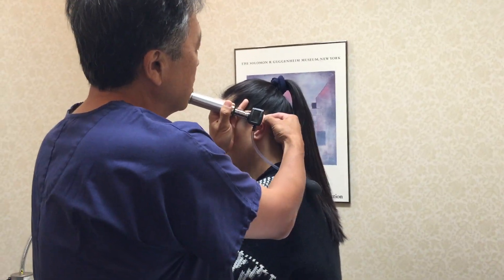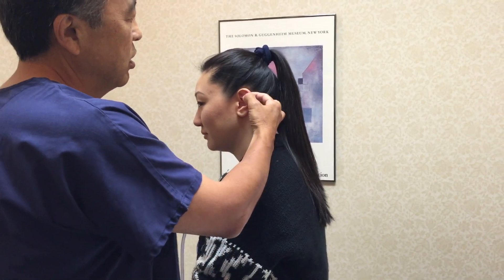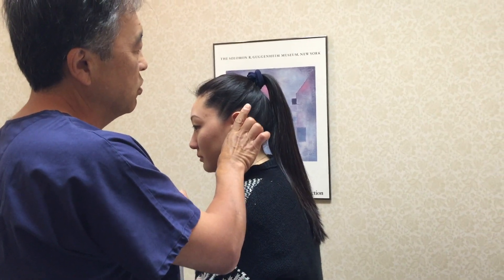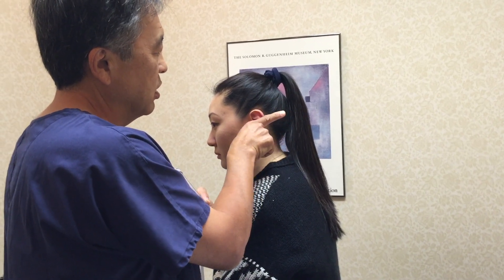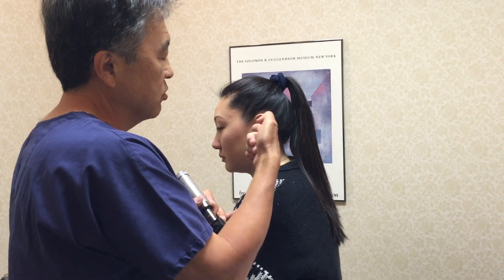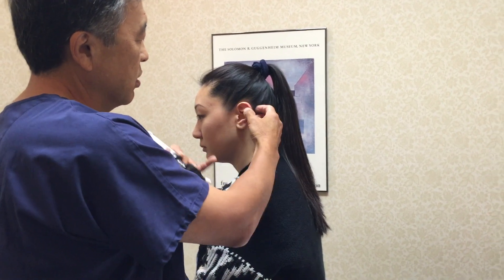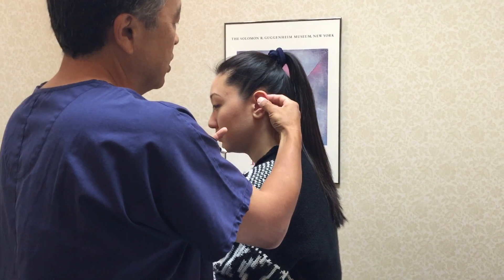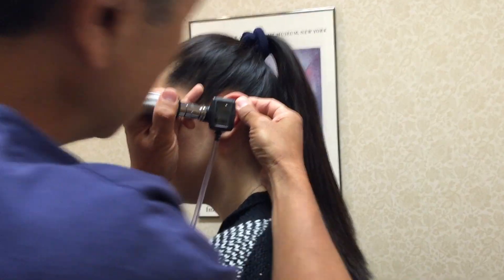Then you can tug on the ear. As you know, to straighten out the ear canal, in adults you need to pull in that direction. In kids, you pull in this direction because kids' ear canals are more horizontal. Adults are more in that direction. So you pull this way, and then you do that — and then you can get in.